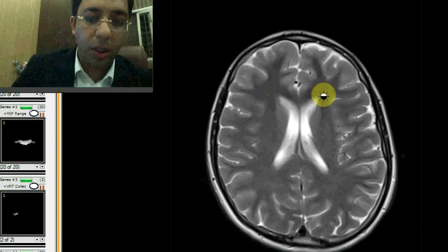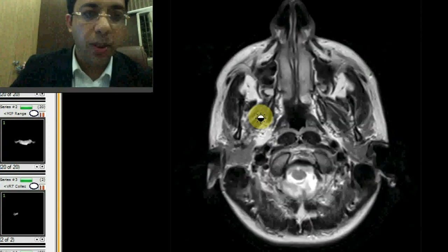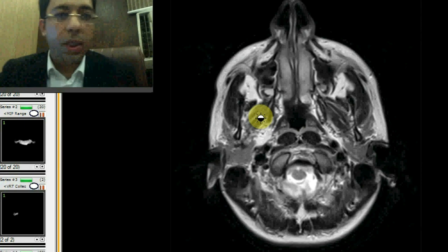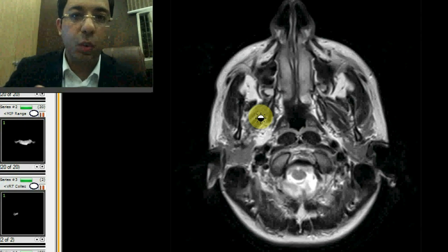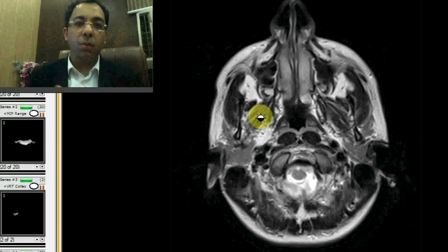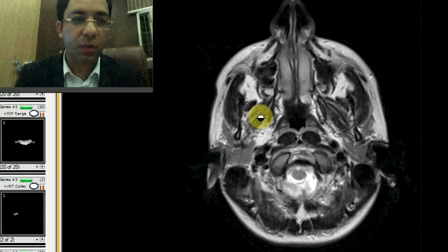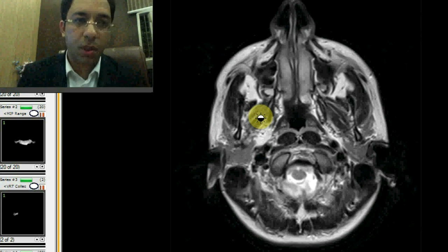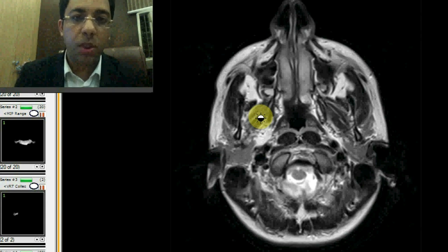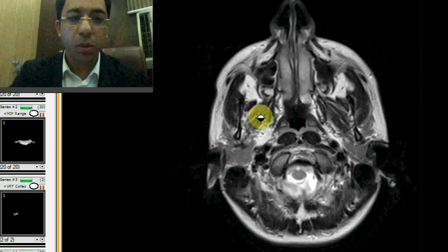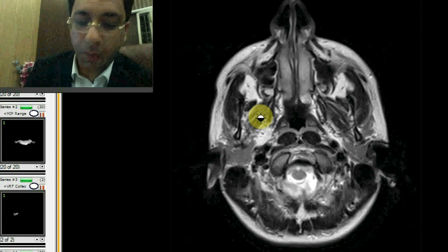I have a T2 weighted transverse image and I will go from bottom up to show you what we are seeing. The key thing to remember is that T2 weighted means you are able to see the CSF as a bright signal — if you see CSF as white, that is a T2 weighted image. T2 weighted images are better for pathology; you can see brain edema because fluid appears bright and pathology appears white.